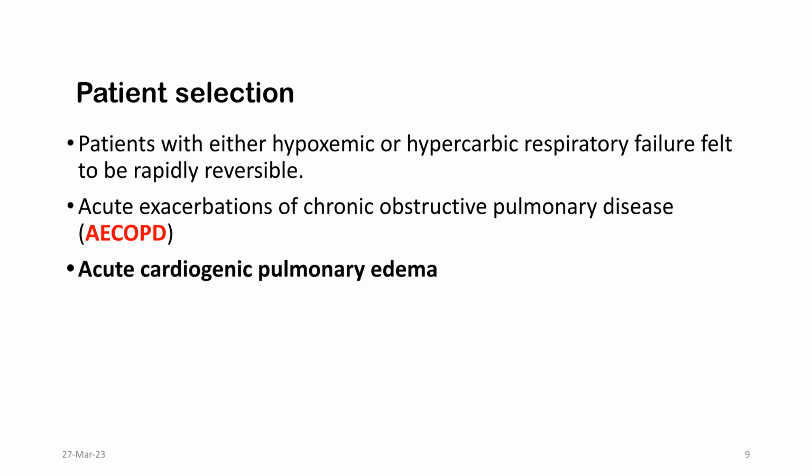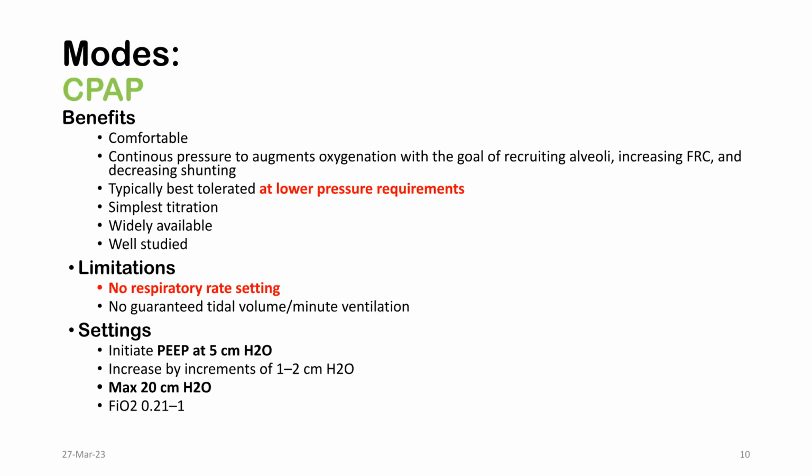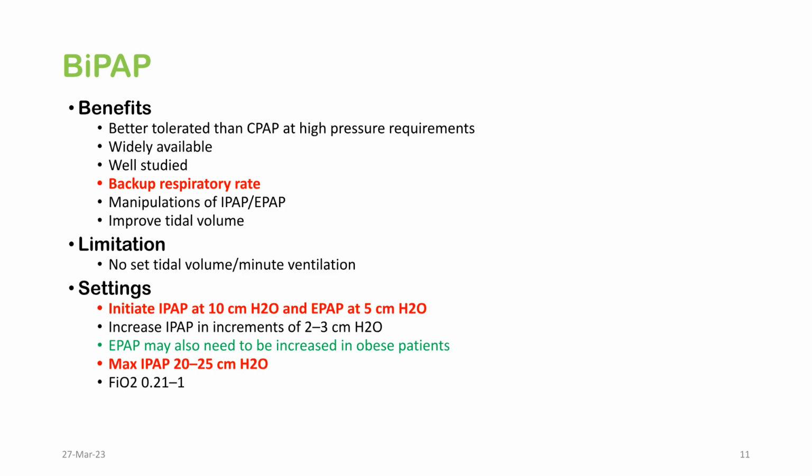Patient selection for non-invasive ventilation includes those with rapidly reversible hypoxemic or hypercarbic respiratory failure, acute exacerbations of COPD, and acute cardiogenic pulmonary edema. CPAP is a non-invasive mode that provides continuous pressure to augment oxygenation. Benefits include comfort and simplicity in titration. A limitation is the lack of a set respiratory rate or guaranteed tidal volume.